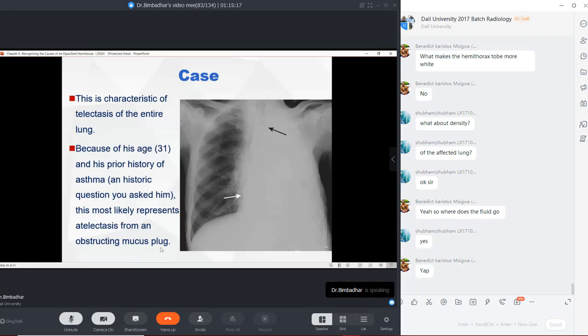So that's the reason I characterized and I diagnosed my first patient, Mr. Smith, as atelectasis, but not pleural effusion, not bronchogenic carcinoma, or pneumonectomy. Did you understand the differences now? Right? Is it clear, people? This is a very important topic. This can be asked for 2 marks questions and 4 marks questions.